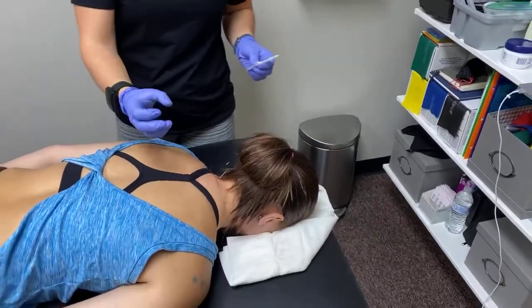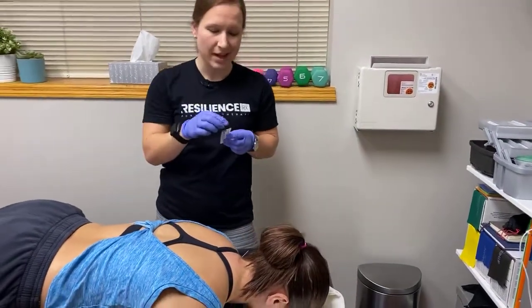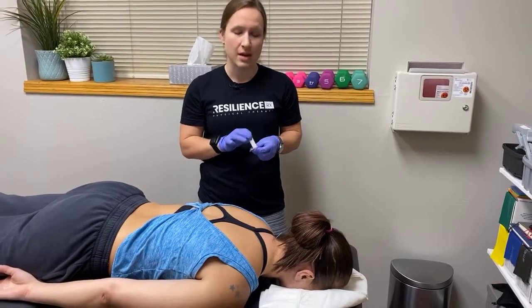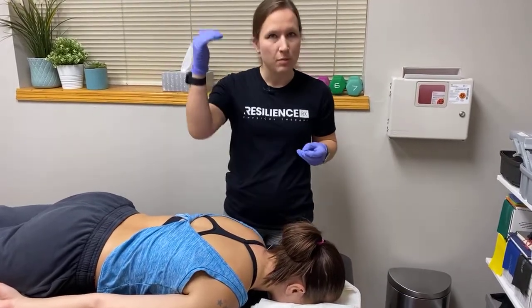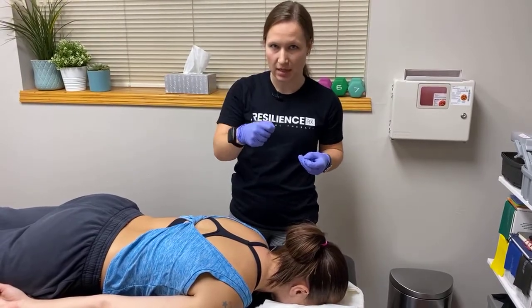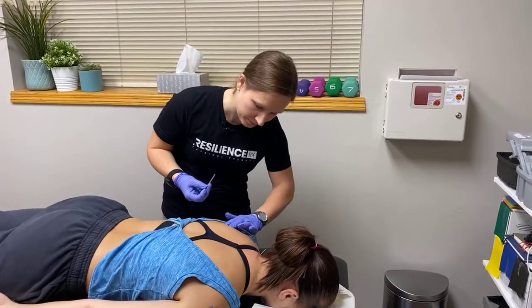So with that one, we actually go all the way down to bone. I made contact with the bone. The needle traveled at different speeds and with different resistances through the different tissues. That means the more resistance, the more dysfunction is occurring in the muscle. So for her, the top layers of muscles, pretty smooth, but I kind of hit a midpoint that was pretty sticky, that was hard to get the needle through, indicating more dysfunction, which is not surprising considering she's got some shoulder pain.